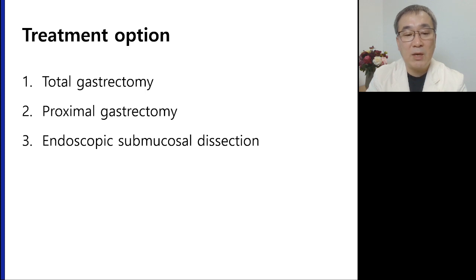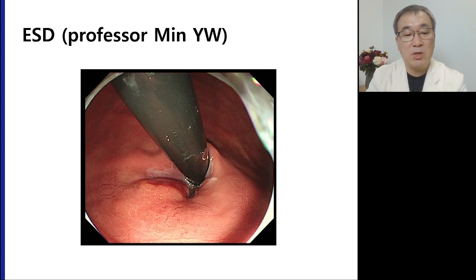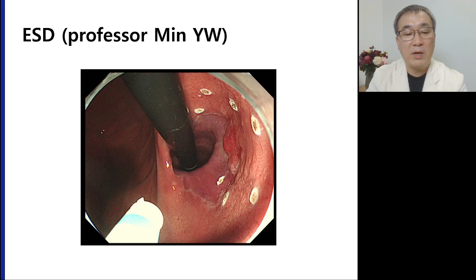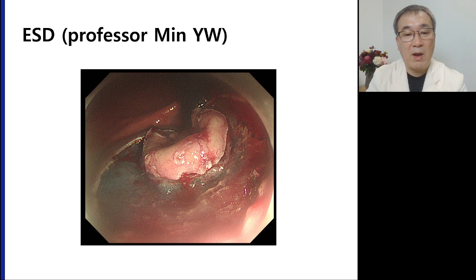Total gastrectomy, or proximal gastrectomy, or endoscopic treatment? My option was ESD. Endoscopic submucosal dissection was done by Professor Yang Won Min of our institution. Standard procedures were followed.